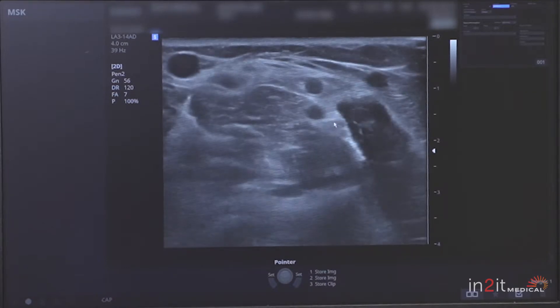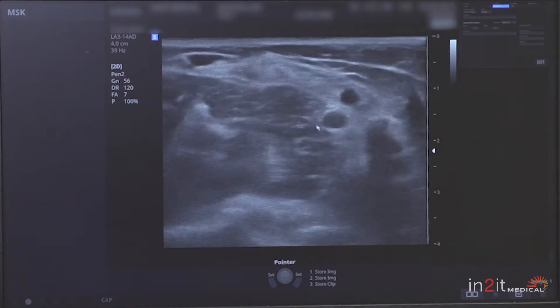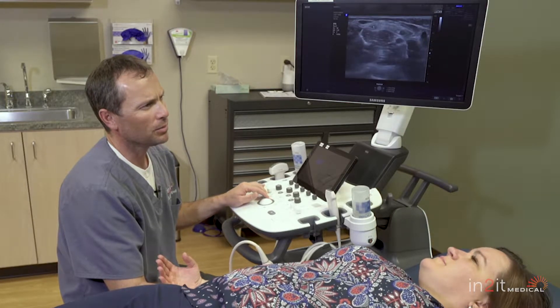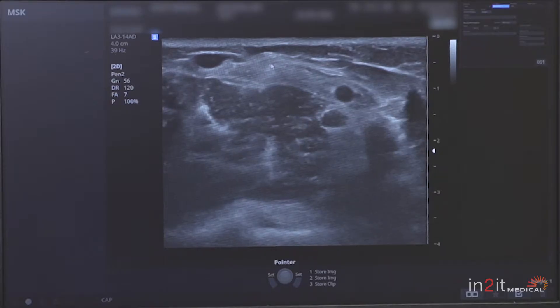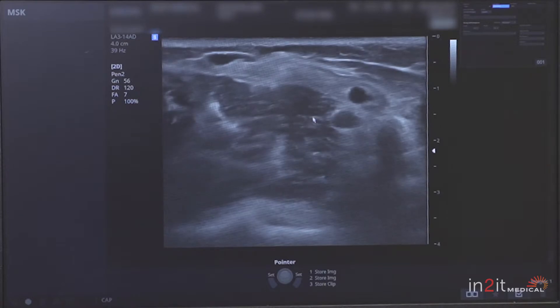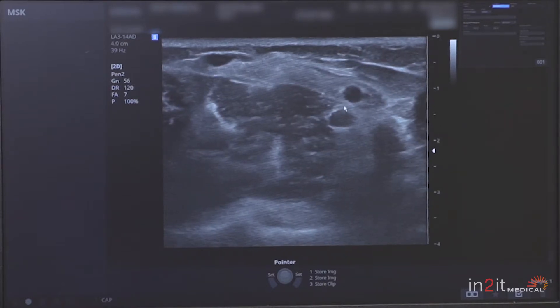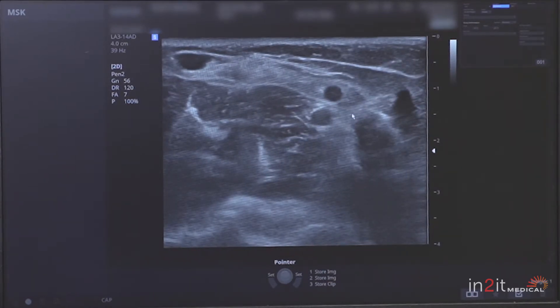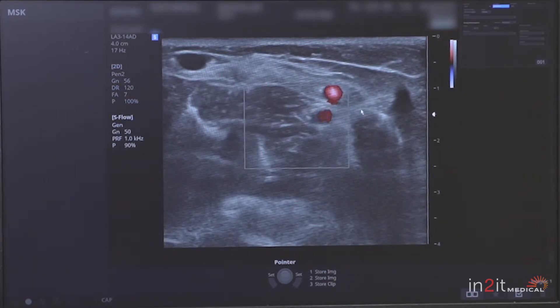We can see it dive underneath the pronator teres muscle, so you can see it at common entrapment sites pretty well. We can also see muscles and tendons. This is the biceps tendon up here — this hyperechoic, or very bright white thing. The beating things are obviously vessels, and those are pretty easy to see. If you put on color you'll see them light right up.